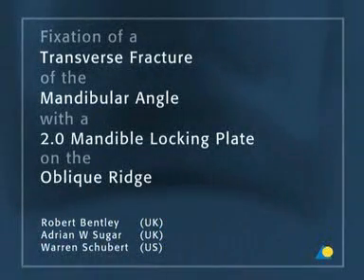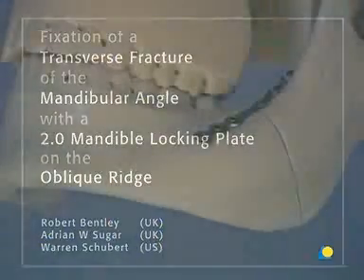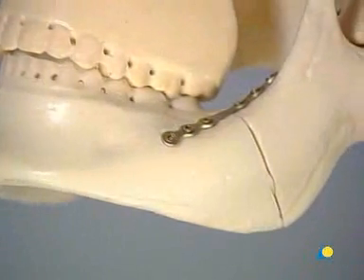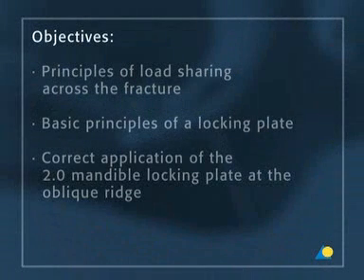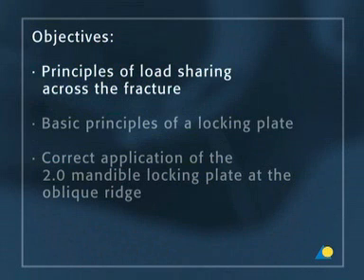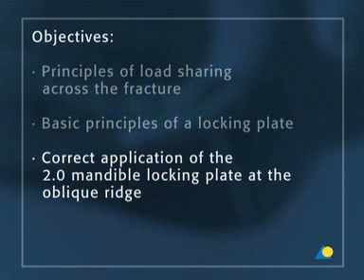A transverse fracture of the mandibular angle is treated with a 2.0 mandible locking plate positioned on the oblique ridge as described by Champy. The objectives of this exercise are to understand the principles of load sharing across the fracture, the basic principles of a locking plate, and the correct application of the 2.0 mandible locking plate at the oblique ridge.